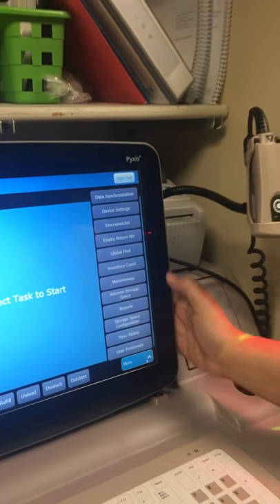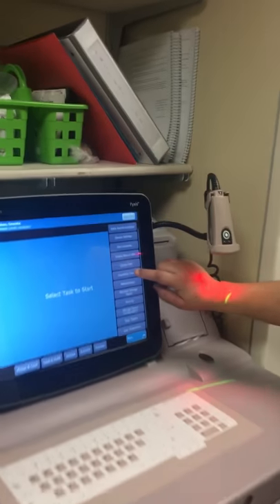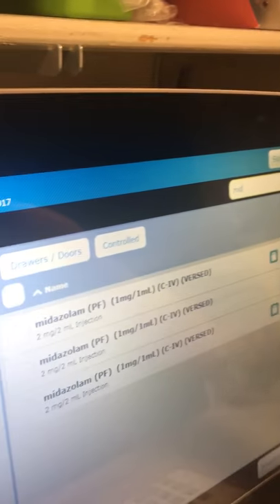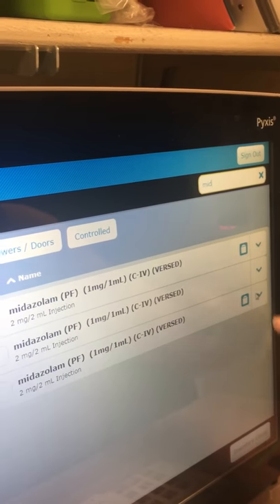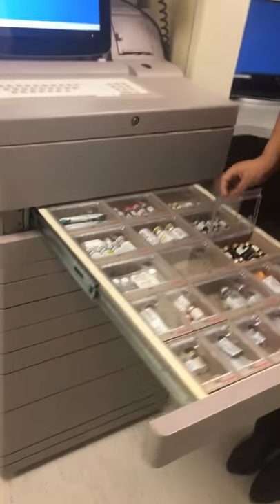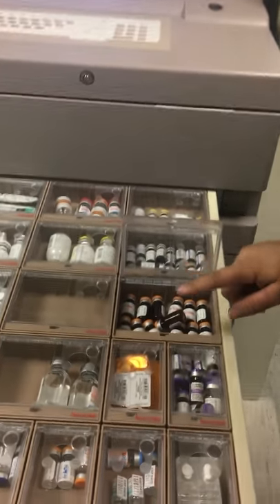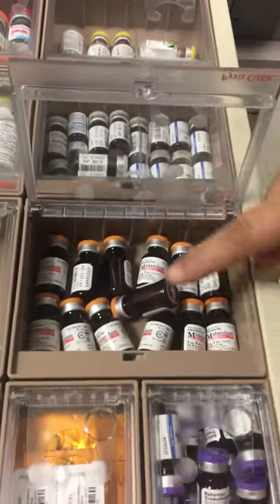Inventory count is used if you want to make sure a pocket has the correct count. For example, let's inventory midazolam. We'll hit inventory count, type in the first couple of letters, and pick a pocket. In this case we have three pockets — let's choose the first one. It gives you two tries to make sure the count is correct. We counted 2, 4, 6, 8, 10, 12 — we have 13 midazolams.